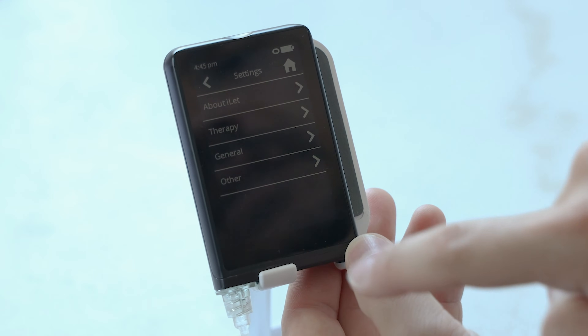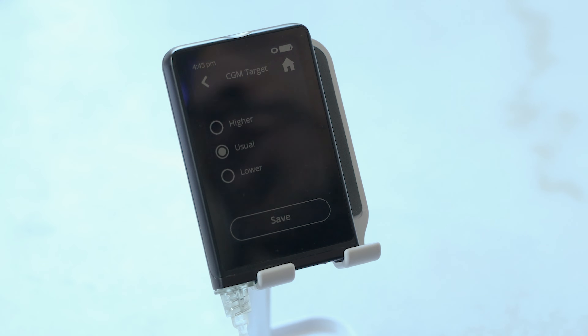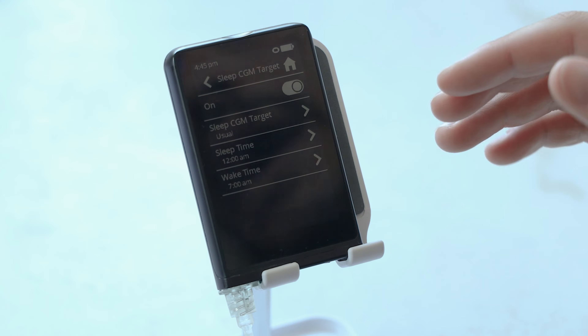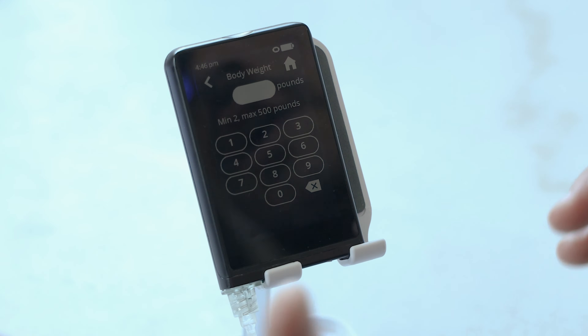Lastly, there's the settings button. The whole point of this pump is to not overload you with too many settings, but there are a few things you can customize. For example, you can customize the CGM target — usual, lower, or higher. You can also adjust your sleep CGM target and set what time you typically go to sleep. The single key setting you put in is your body weight. You can change it as often as you want, but from my interview with the CEO, he said you really shouldn't change it often unless your weight changes by 15%. There's also a limited access mode under 'Other,' which is great for children.